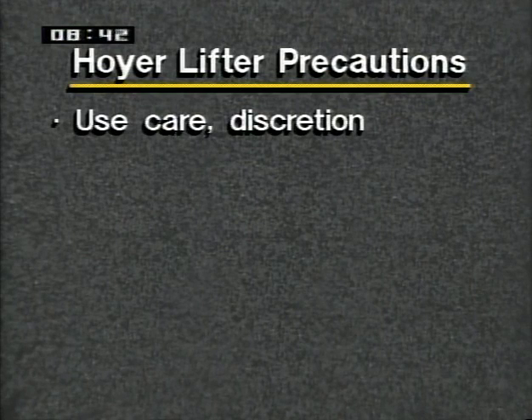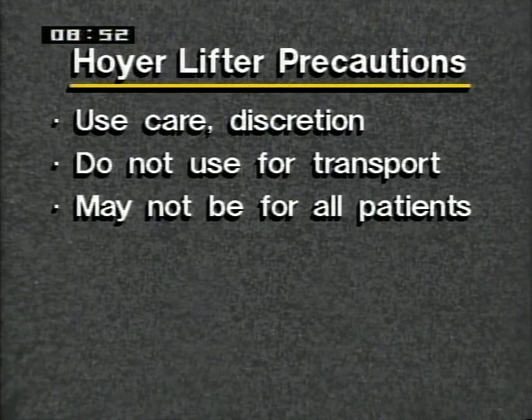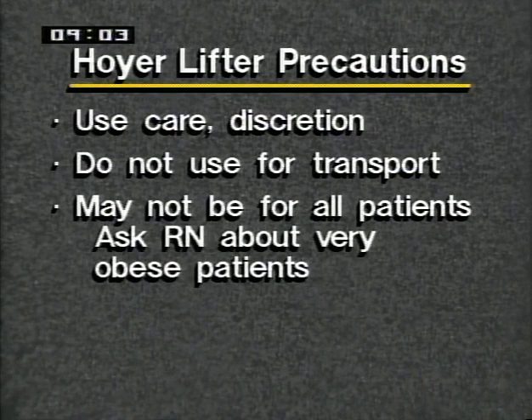In operating the lift, follow these precautions. The Hoyer lifter is a transfer device. Use care, discretion, and common sense when transferring patients. The lift should not be used to transport anyone. The lift may not be the way to move all patients. The manufacturer's instructions state the maximum weight which can be lifted safely is 400 pounds. However, if your patient is very obese, regardless of the weight, or if you have any concerns, check with your supervisor.